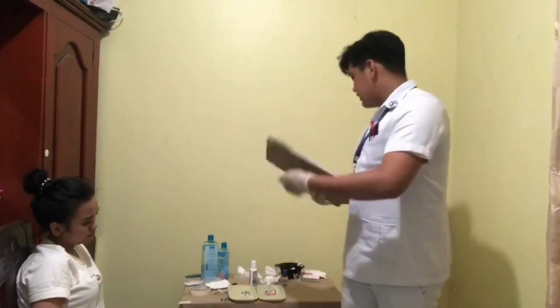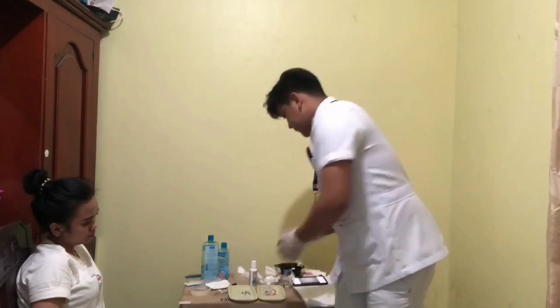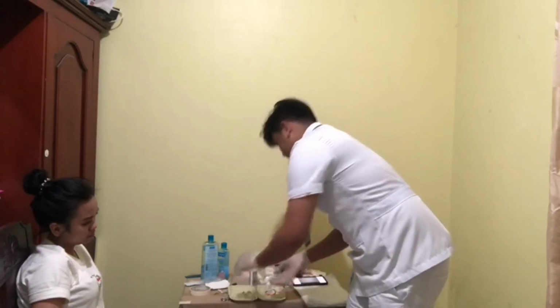We'll also cross-check the label on the medication carefully against the MAR to make sure that we have prepared the correct medication. Next is to follow the 3 checks for administering medication, and this is to read the label on the medication when it is taken from the medication card, before withdrawing the medication, and after withdrawing the medication. This is also for making sure that we have the right medication to administer.